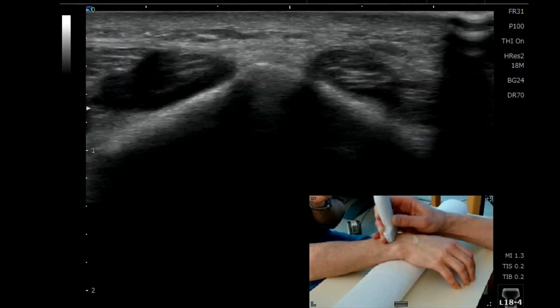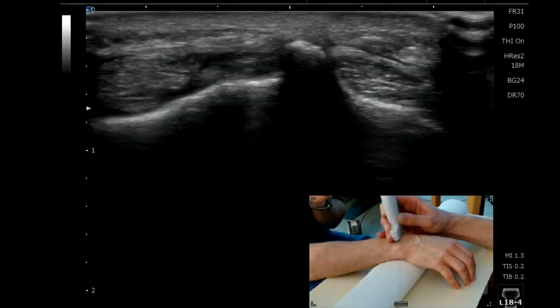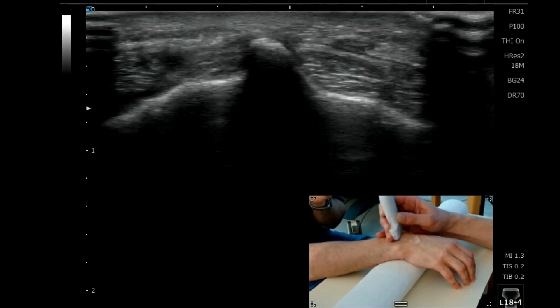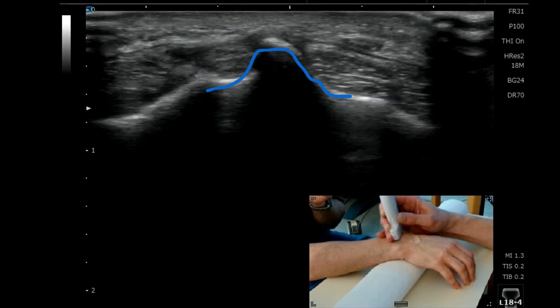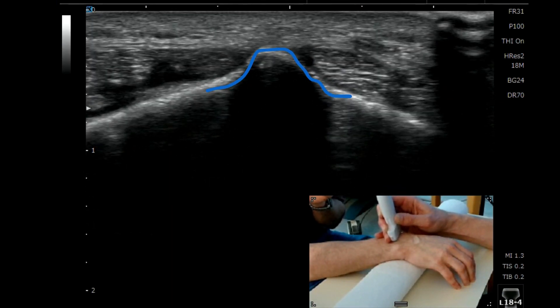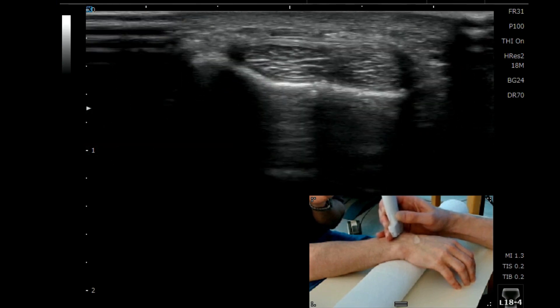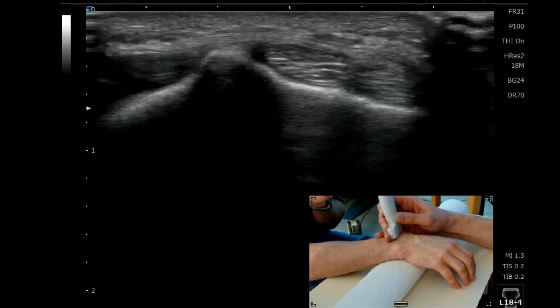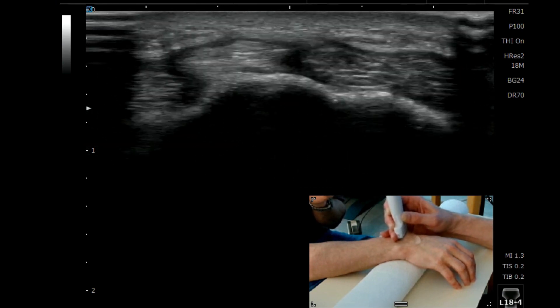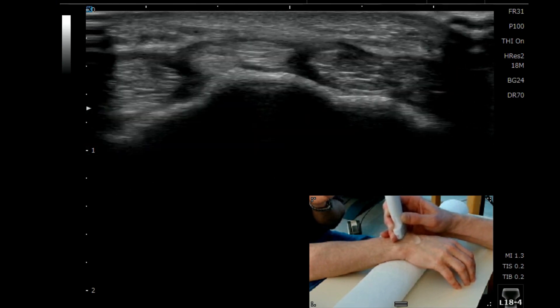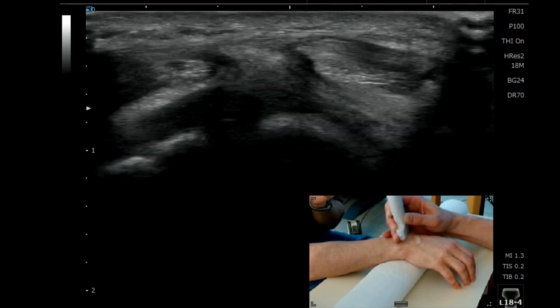To find the scapholunate ligament, we're going to find Lister's tubercle again on the dorsal aspect of the wrist. You've got the second compartment there, and the third is coming over the top.